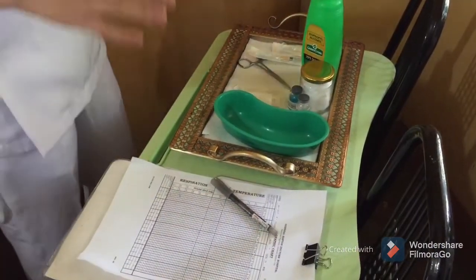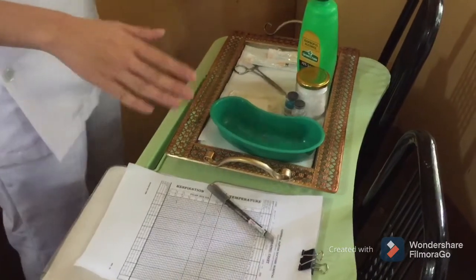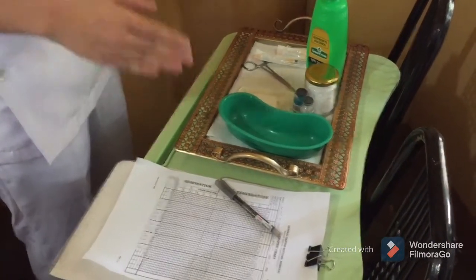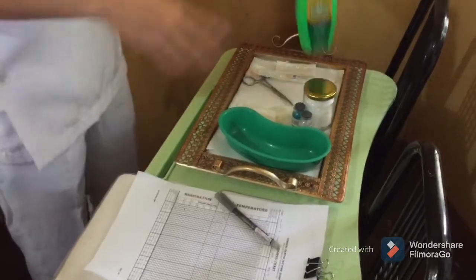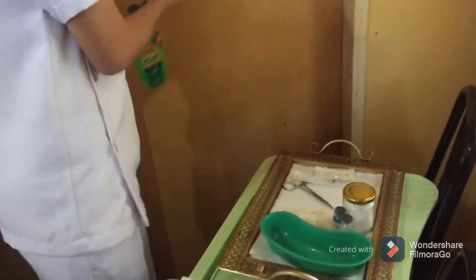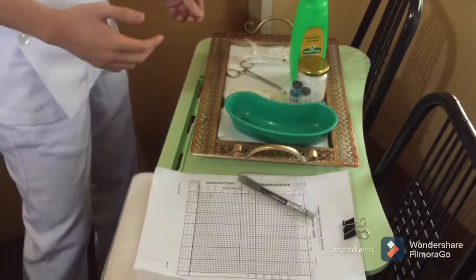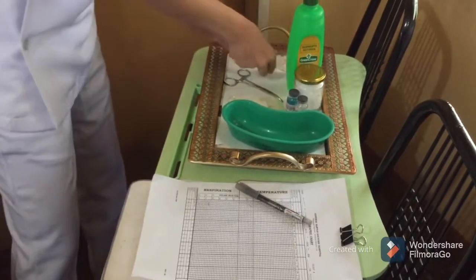Then after that, we are now going to organize the equipment so that we are less likely to waste time. And also we are now going to perform hand hygiene so that we are less likely to harbor microorganisms, and for infection control. We are going to prepare the medication from the vial.